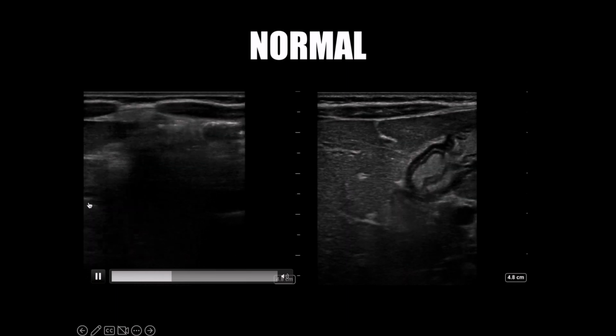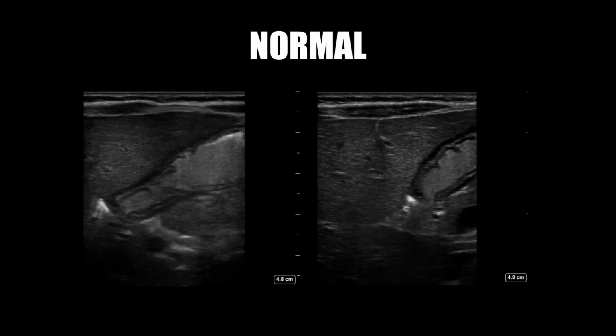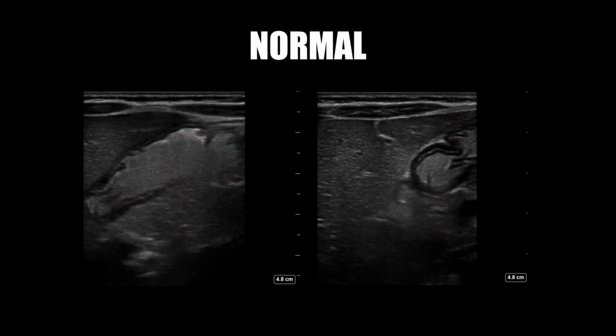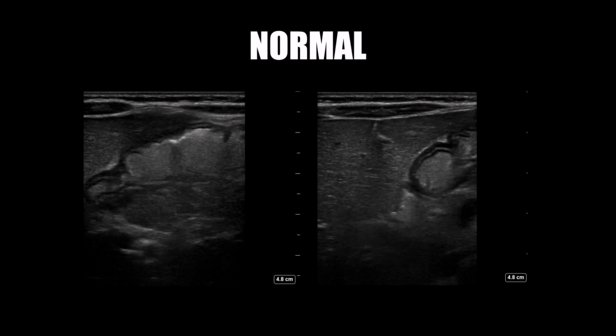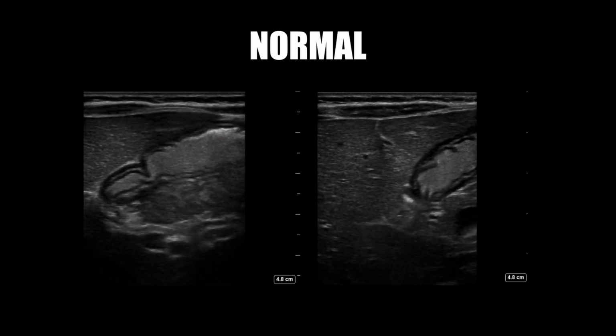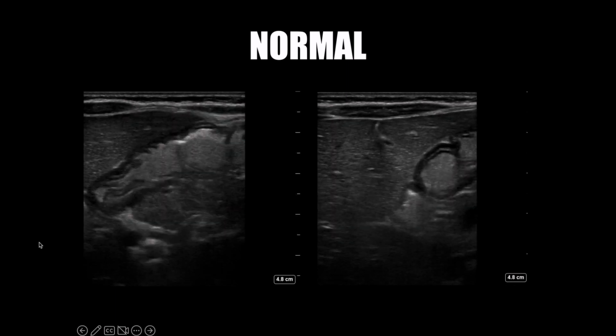Now, in a lot of cases, the pylorus itself doesn't really stand out from the rest of the stomach when you quickly look. I'll say when you look at our own radiology departments, in normal pyloric ultrasound studies, they routinely are not making any measurements. You can tell just qualitatively there's nothing enlarged, there's nothing worth measuring. You can see this gastric content is coming through here, and it looks to be freely flowing out the back end of the stomach here.